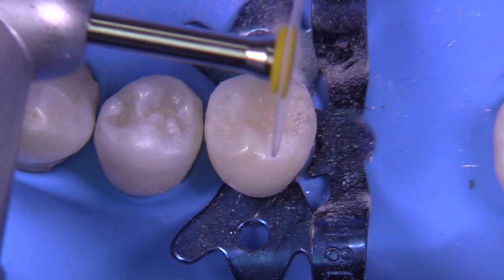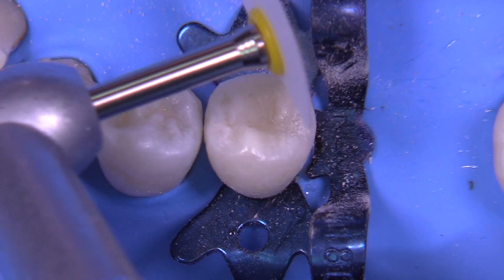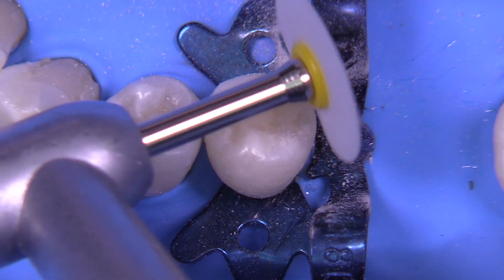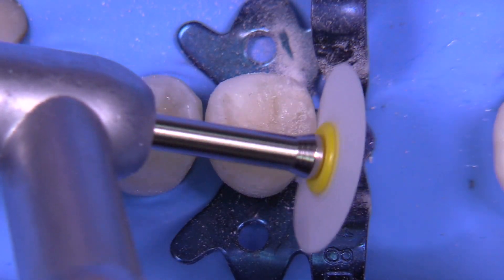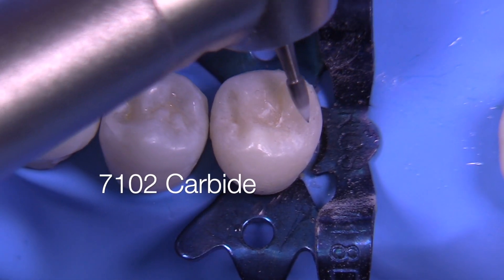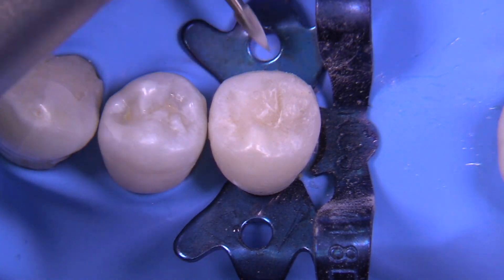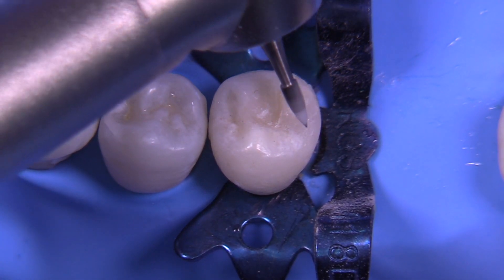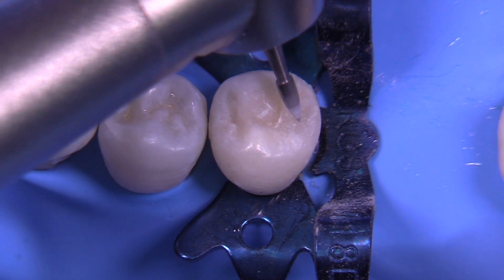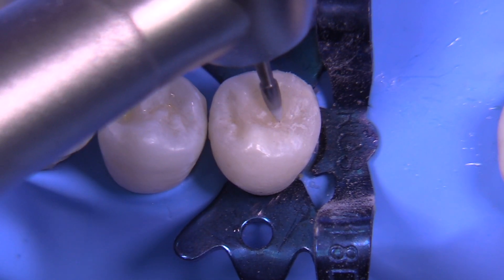Keep the disc running from composite to tooth structure, and constantly change direction — clockwise or counterclockwise — so you're always keeping the direction in that manner. You can do a really good job of almost getting a polished surface with the lemon disc. The last one — I call it the lemon — is the 7102 carbide, probably the all-around best worker for anatomy I've found. It's not too wide, not too thin, with a very sharp point to get down into the anatomical areas of the grooves.